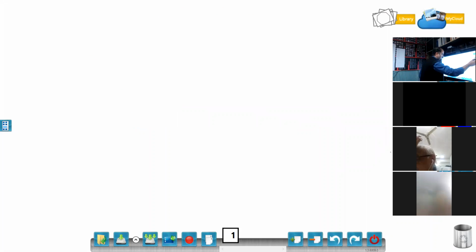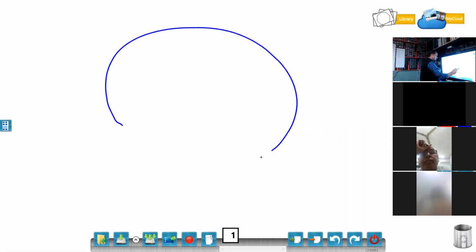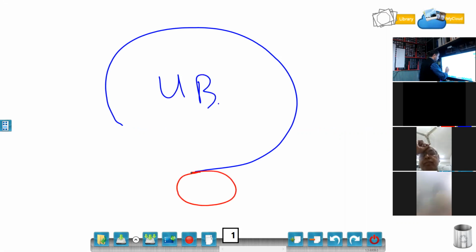Now the prostate. This is the bladder, and this is the prostate over here. The important point is, whenever I am taking the volume of anything, be it the ovary, the bladder, or the prostate, I have to take 3 measurements.